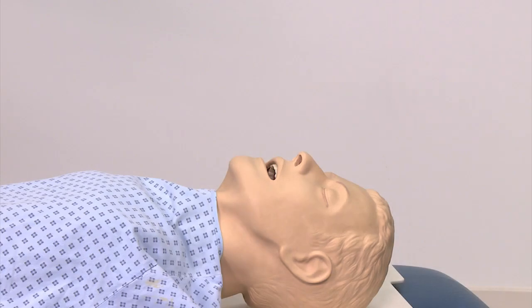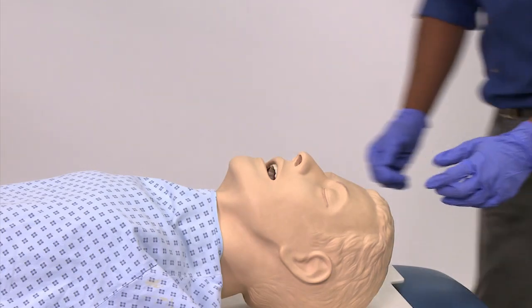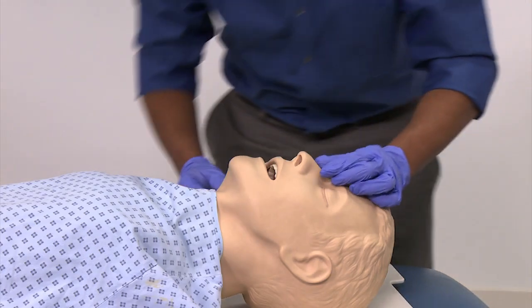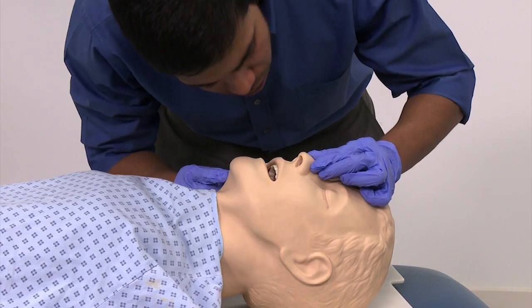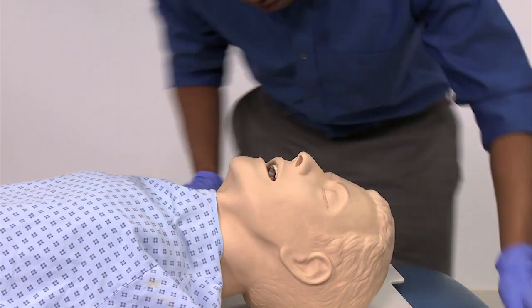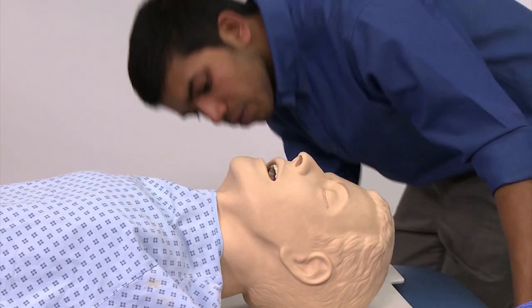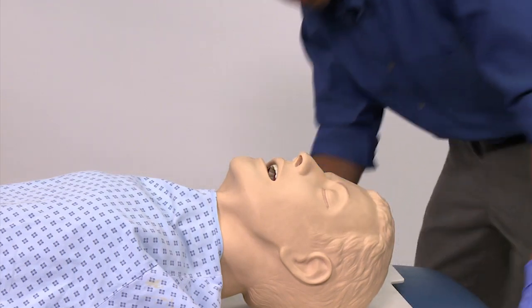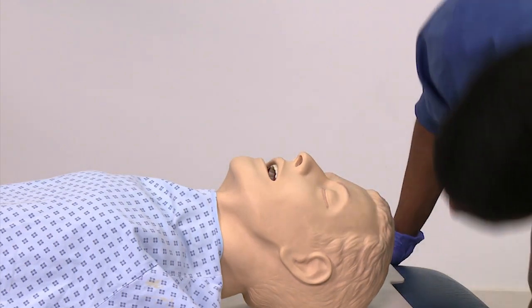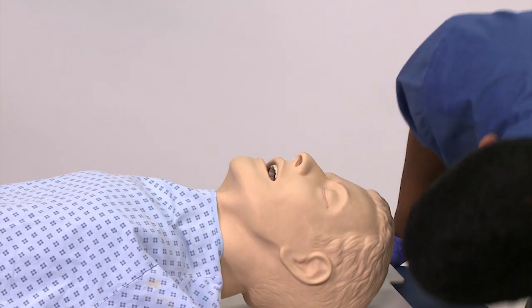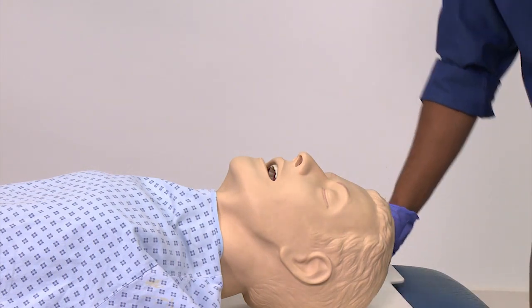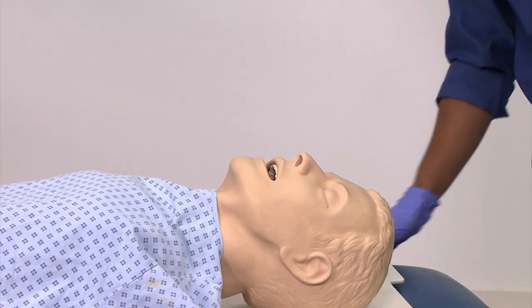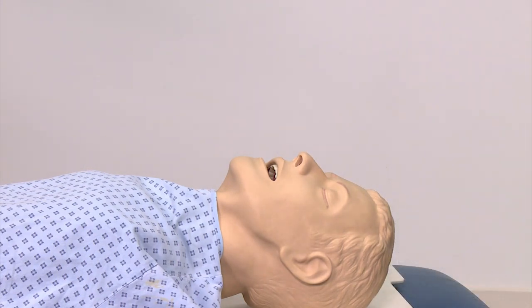First, check that the nasal passages are viable. If there is any indication of basal skull fracture, do not attempt a nasopharyngeal airway due to the risk of inserting it through a possible cribriform plate fracture and injuring the brain.